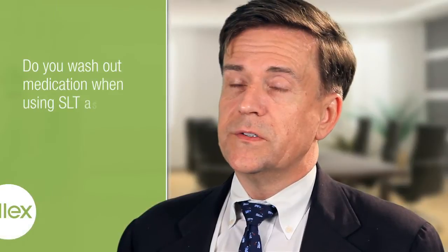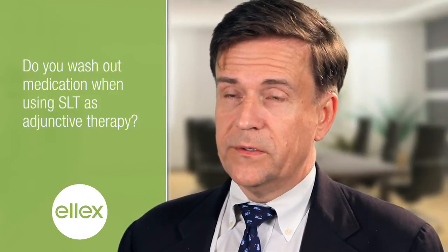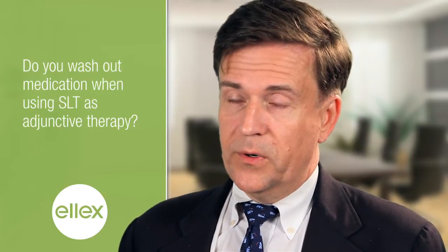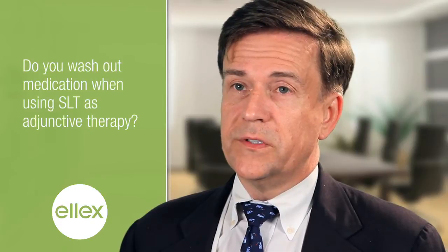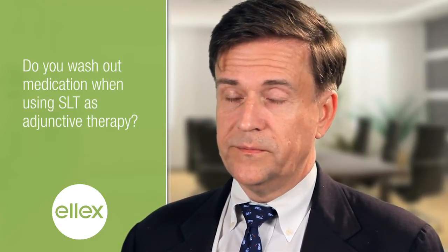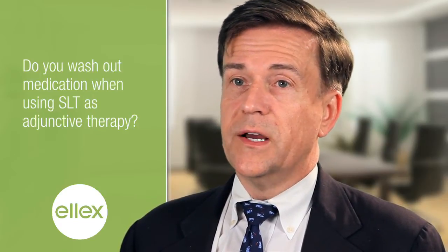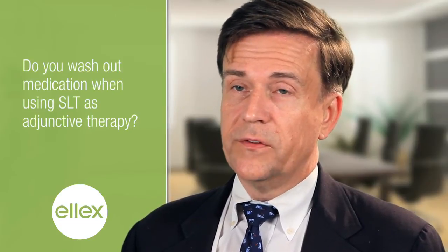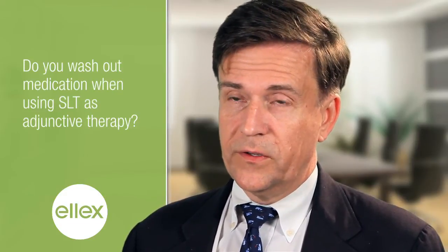When I treat patients, what we call secondary treatment, patients who are on medications, what we do is we keep them on the medication and we treat both eyes. I wait 2 months because there are late responders as late as 8 to 12 weeks, and we check the pressure. If a patient is on 4 medications, say, the first medication we'll stop is the prostaglandin because SLT functions as an outflow agent and prostaglandins are an outflow agent.